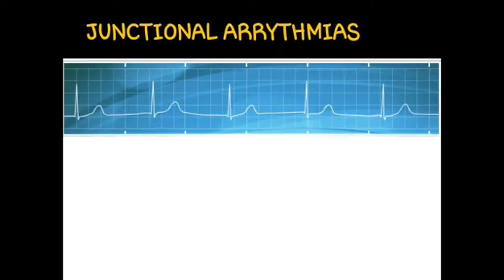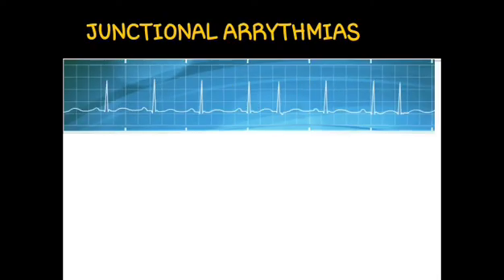Okay. So before we take note of the junctional arrhythmias, please consider that with junctional arrhythmias, there is either an absent P wave or an inverted P wave.